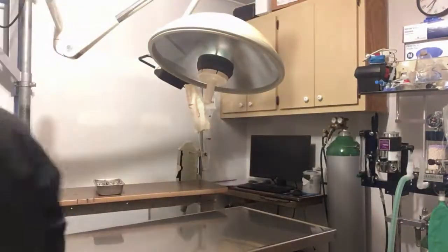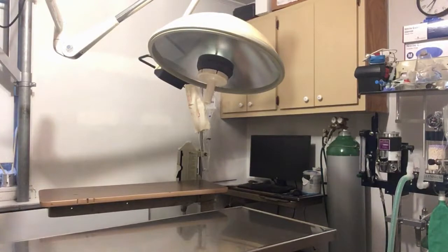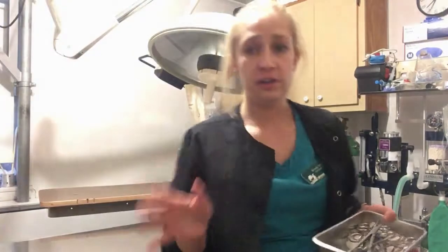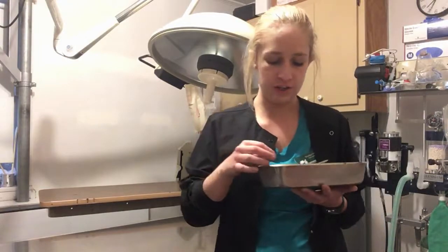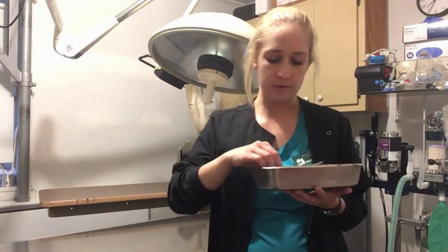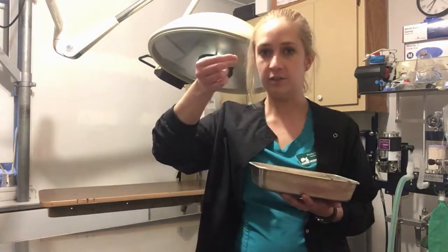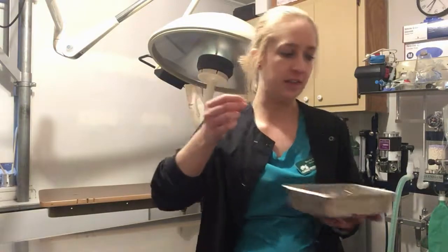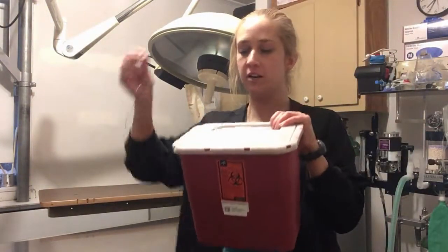Then you're going to take your instruments. When you are done with all of the things your surgeon used during the surgery, you're going to dispose of the things that need to be disposed of. The big thing is disposing of your needles and scalpel blades. Those go in your sharps container.